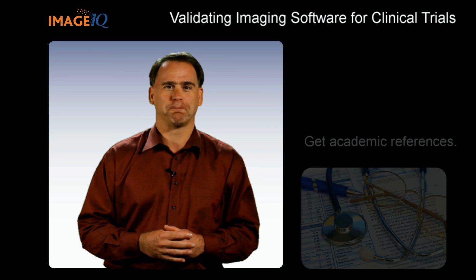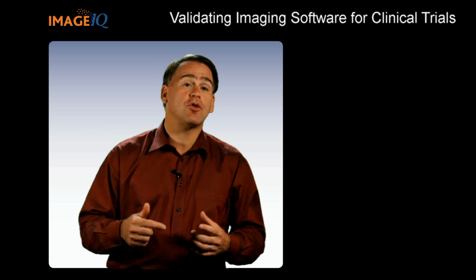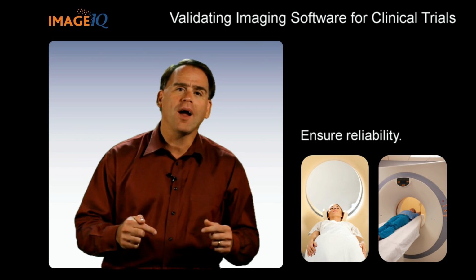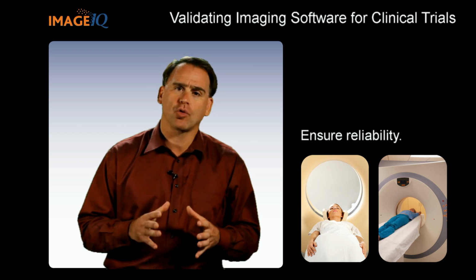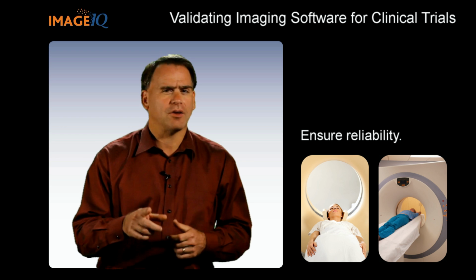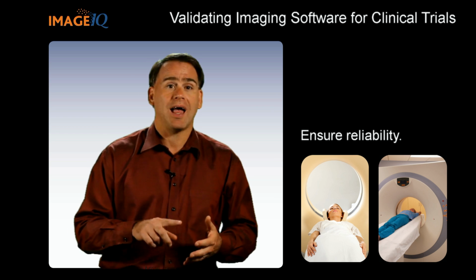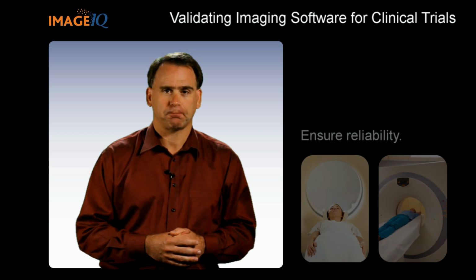Next, ensure that all the scanners you're using in the trial at all your sites can acquire the images with the appropriate characteristics so that your analysis can be reliably run. And, just a reminder, make sure you document the scanner make, model, and software version number.